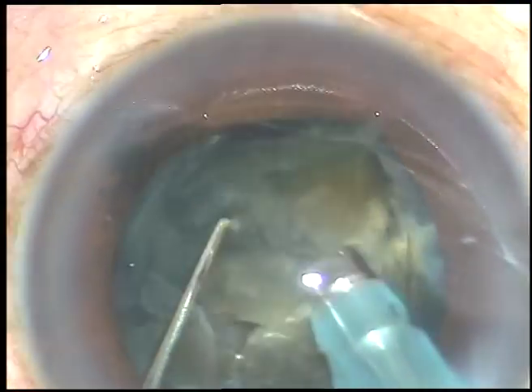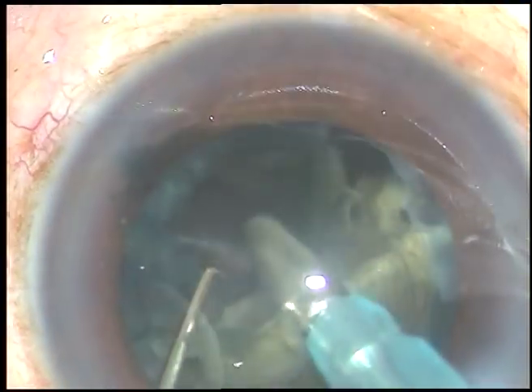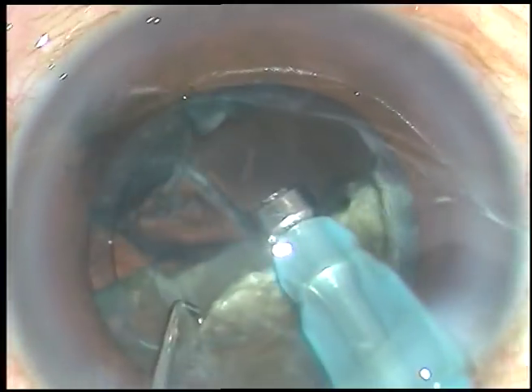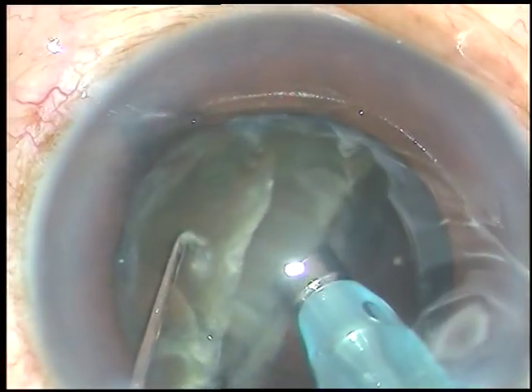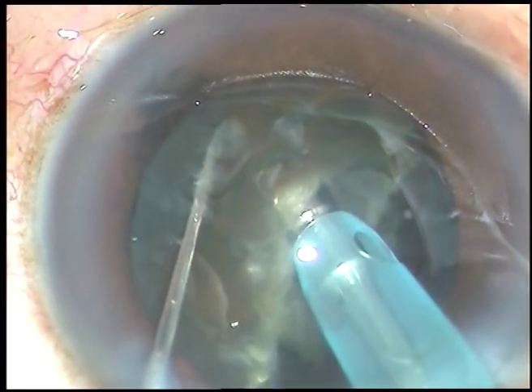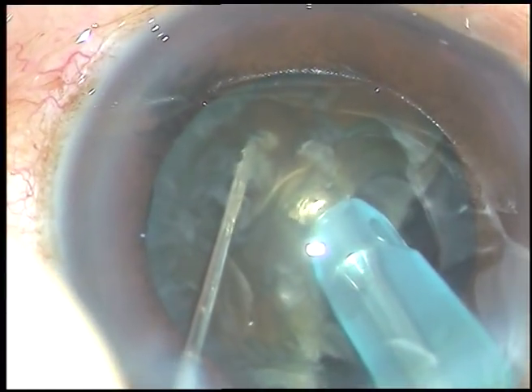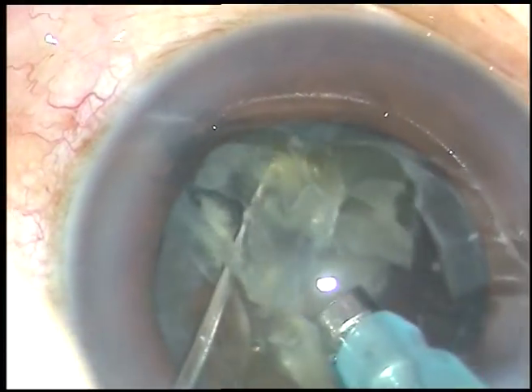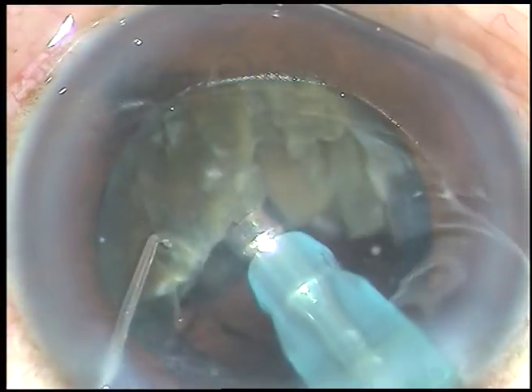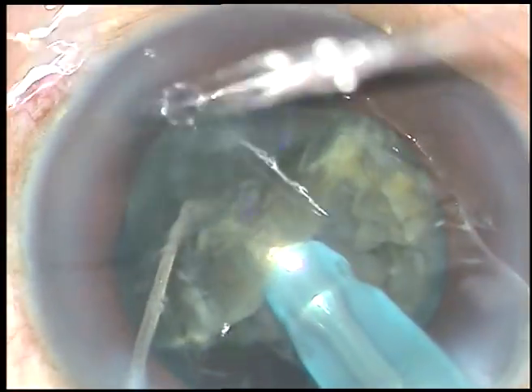Friends, it is a joy to do safe phaco. The anterior chamber should be very stable. There should not be any surge. You should know your machine very well. This is the other hemi-nucleus. It is being chopped into three parts because I saw that it is quite big and the nucleus is quite hard.